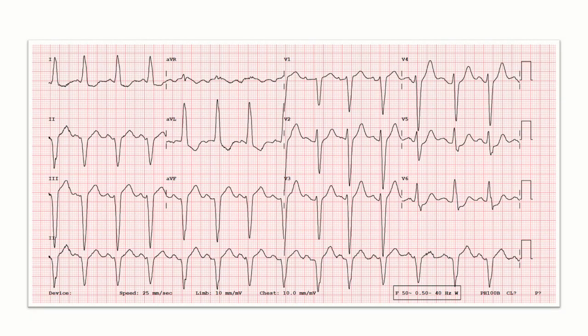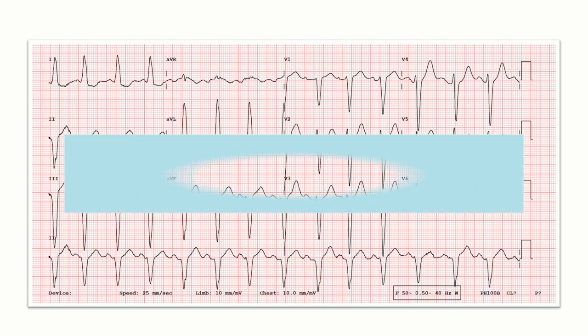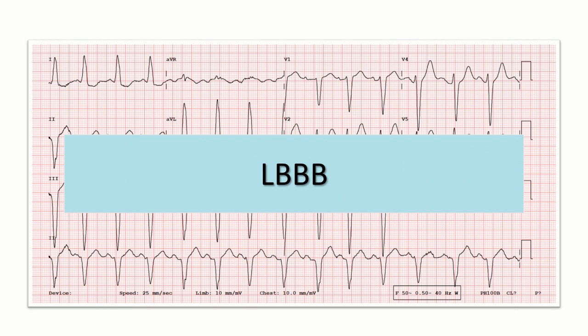After fulfilling all the criteria of left bundle branch block, we can now confidently say that this patient has left bundle branch block in his ECG. I would like to add one more point: if an ECG fulfills all the criteria of left bundle branch block except that QRS duration is less than 120 milliseconds, then it is called incomplete left bundle branch block.